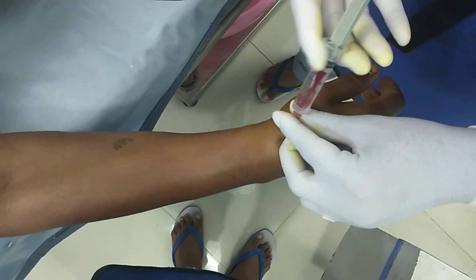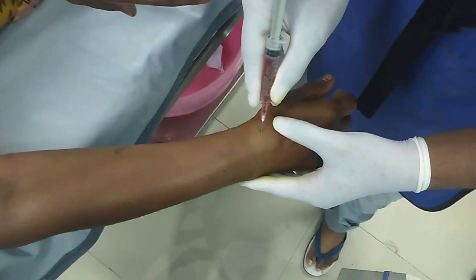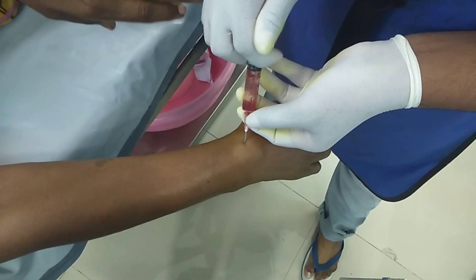We can see the blood clots coming. After confirming it, just inject 4 to 5 cc of xylocaine into it.